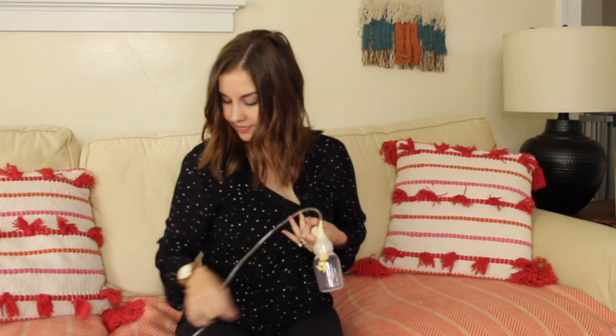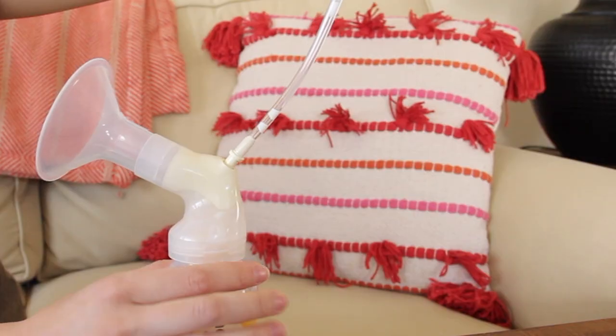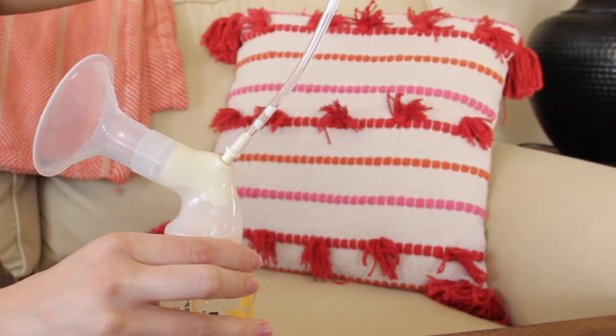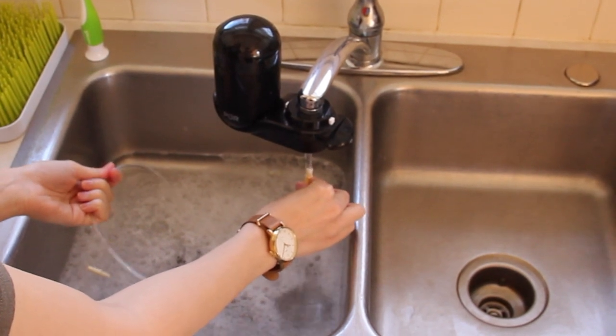Some things to keep in mind about the Medela Swing: it is a single pump, meaning you can only pump one side at a time. This is also a single user pump, meaning it's not meant to be shared — it's for you and your milk only. The reason being is that the Medela Swing is an open system pump, which means the milk could get unintentionally drawn into the tubing or the pump's motor. Closed system or multi-use pumps are the ones that could be shared. If you ever notice milk does get caught in the tubing, just follow the manual's instructions to keep things clean and prevent the growth of mold.